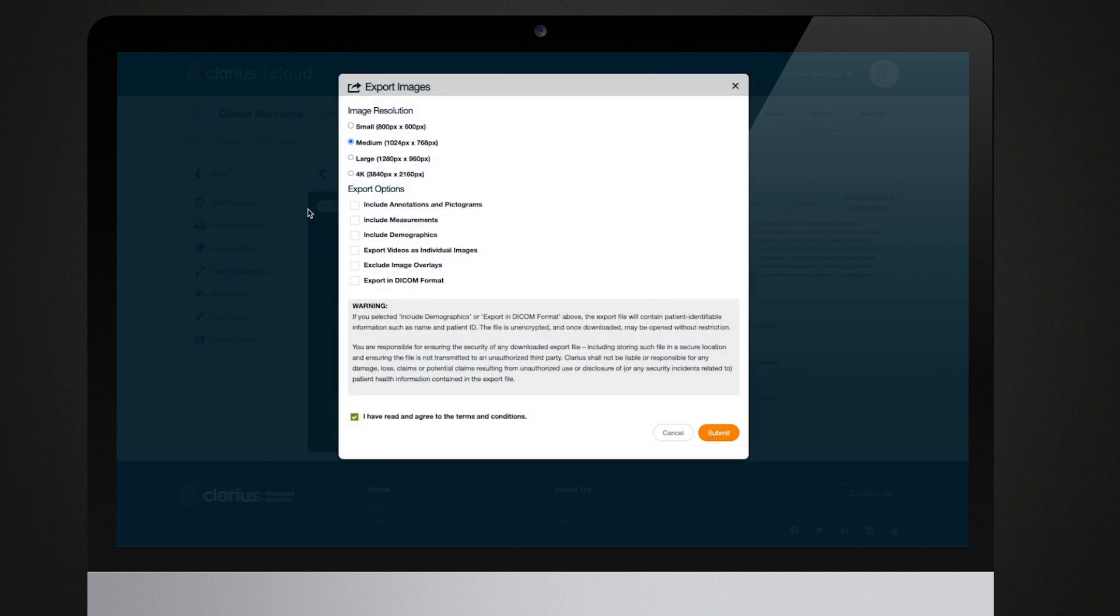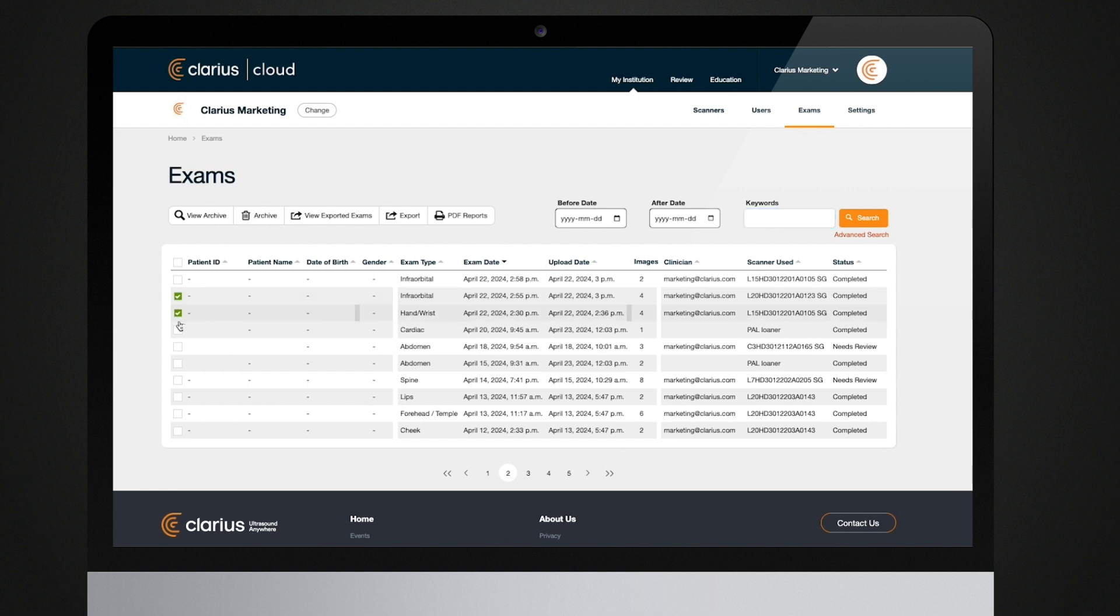You can choose your desired resolution and whether or not to render annotations or pictograms on the exported images. You can also export images from several exams on the exams page.